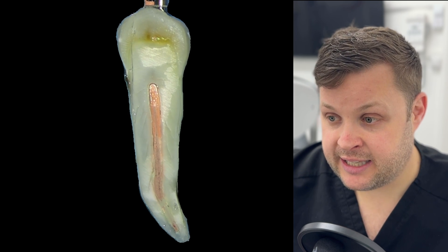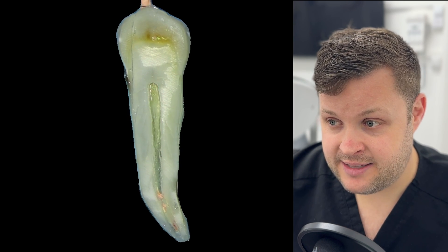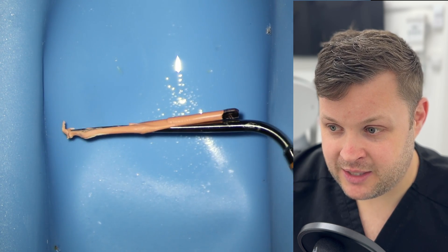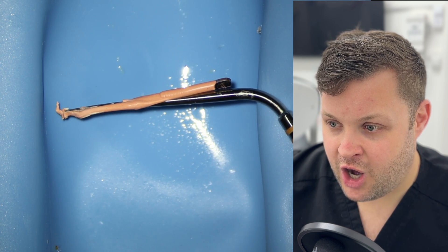You're going to get your heated plugger, activate the heat, and push down until you reach that point about five millimeters away from the apical end. You're going to count for 10 seconds and continue to push down. Once you get to that mark where you've been pushing down for that length of time, you twist and pull it out — and ideally you pull out all of the GP on the heated plugger, leaving about five millimeters of GP from the apical end.